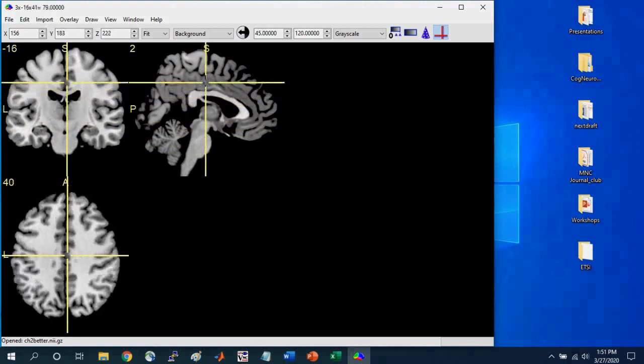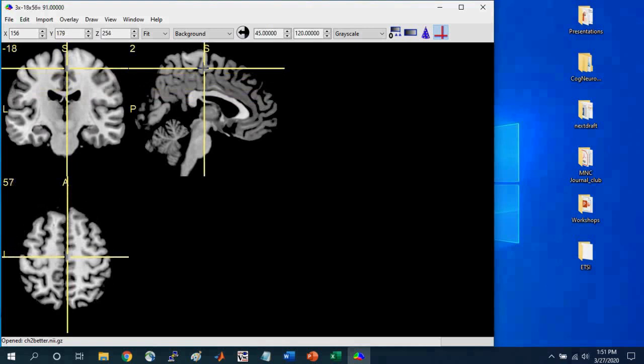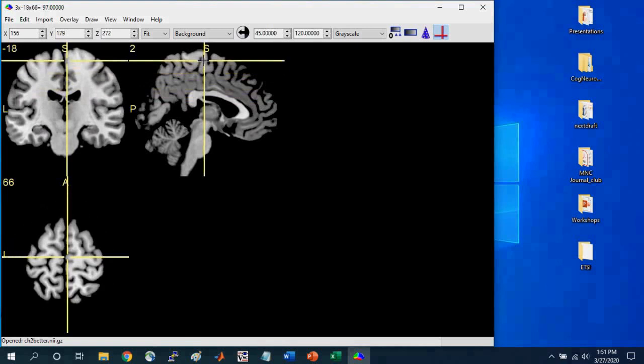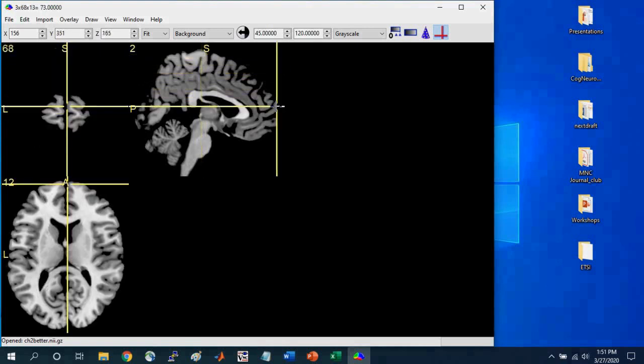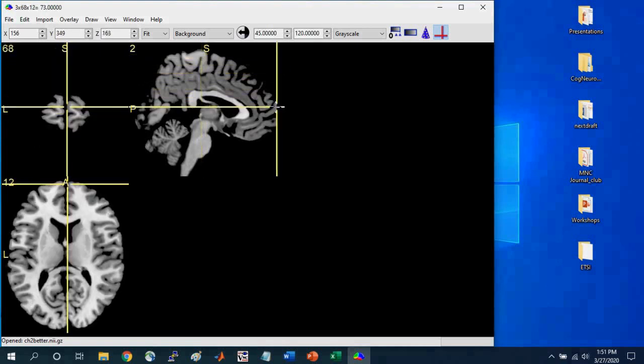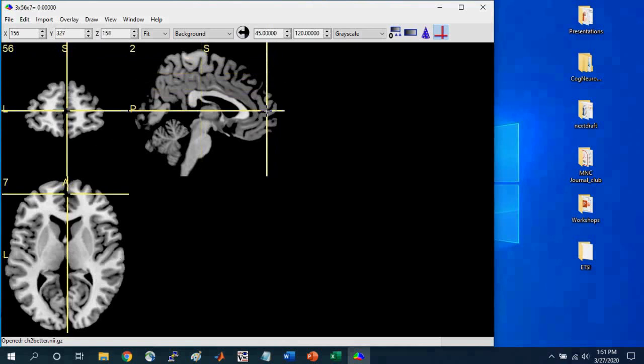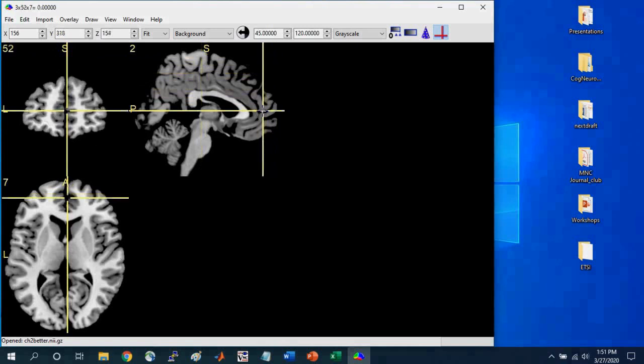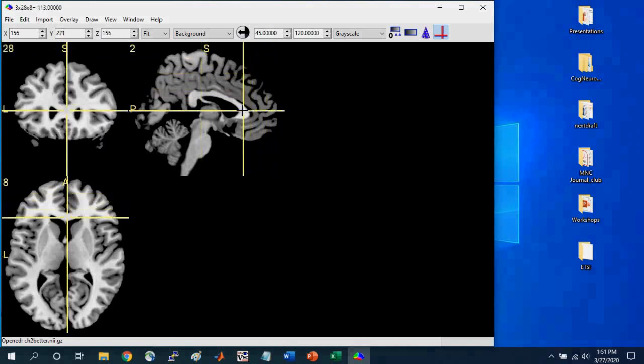We can also start at the front of the brain, so the anterior portion of the brain, and proceed posteriorly. And you can see in the coronal slice, you can see the slices changing.